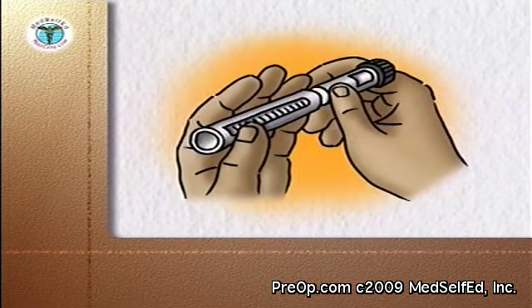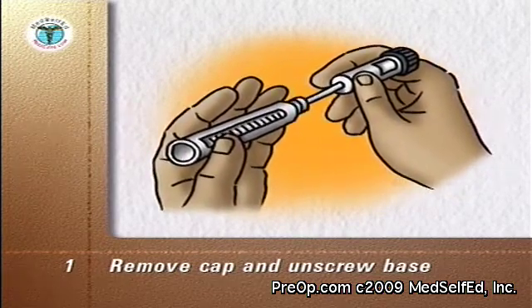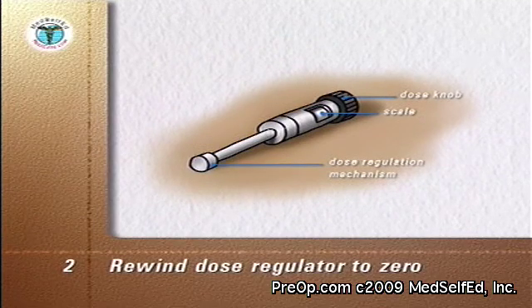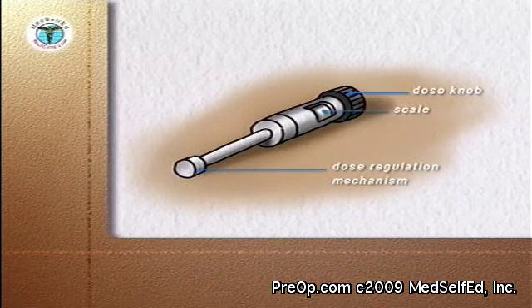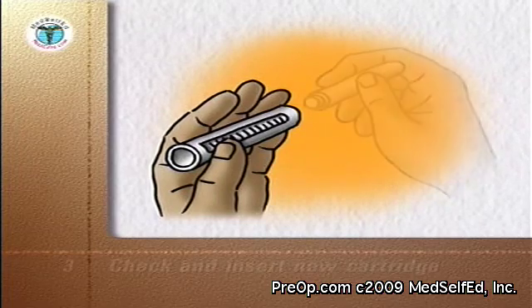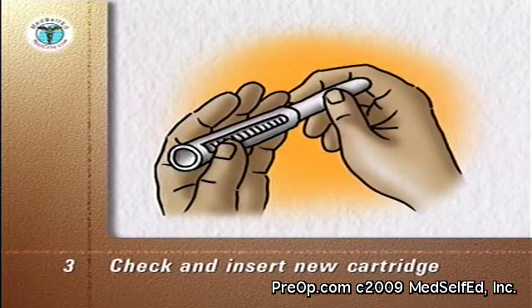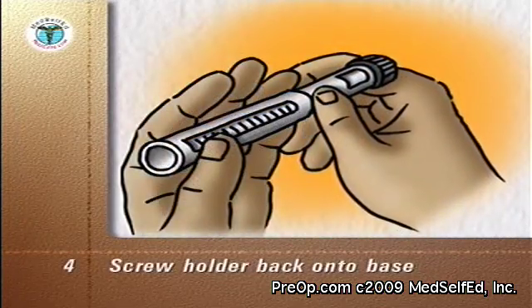Follow the manufacturer's instructions to remove the cap. Separate the base from the cartridge holder by unscrewing it. Rewind the base dose regulating mechanism back to zero and put down the base. Pick up the cartridge holder, shake out the used cartridge, check that the new cartridge contains the correct insulin, and insert it metal end first into the holder. Screw the cartridge holder back onto the base.